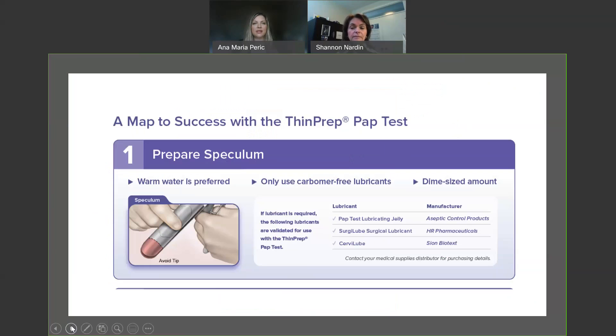A quick note on speculum insertion: we would really prefer that warm water be used, and that is generally more than sufficient for most patients according to many of the clinicians we have worked with. However, there are certain patients that will require a little bit of lubricant. For that reason, we have tested all of the lubricants on the market to see which ones are compatible with the methanol-based preservative that you'll be putting the sample into. Of all the lubricants on the market, three of them did not clump up and coagulate when placed into the methanol-based preservative. The one that is readily available to you in Saskatchewan is the SurgyLube Surgical Lubricant. If you are going to use this lubricant on a patient, please use it sparingly — a dime-sized amount applied to the middle of the speculum, avoiding the tip.